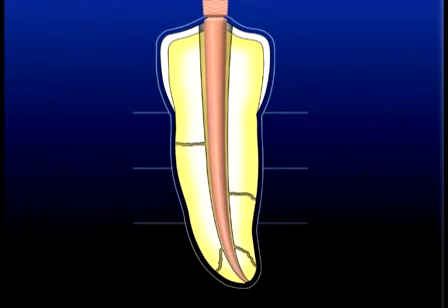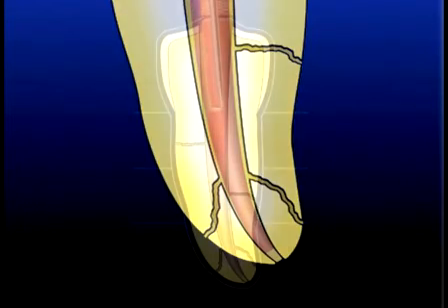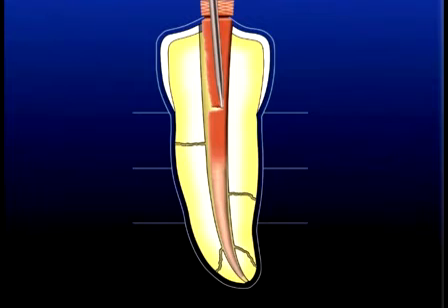A non-standardized cone of gutta percha is selected that closely resembles the dimensions of the cleaned and shaped canal. Generally, a fine medium or a medium non-standardized master cone is selected and fitted so that the rate of taper of the master cone is less than the rate of taper of the preparation. Master cones are fit to the radiographic terminus and confirmed with the radiograph. The master cone is then trimmed back based on paper point drawing. After drying the canal and placing sealer, the master cone is inserted. The heat carrier is activated and the non-useful portion of the cone is seared off and removed either at the CEJ in single-rooted teeth or at the orifice level in multi-rooted teeth.